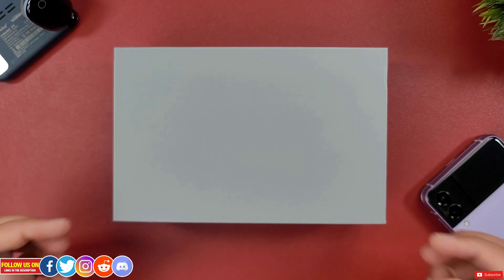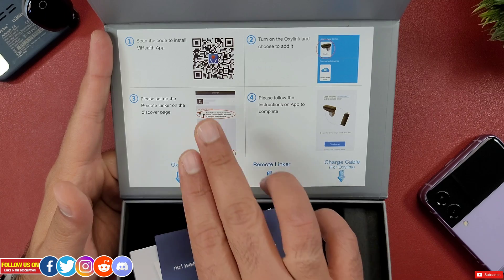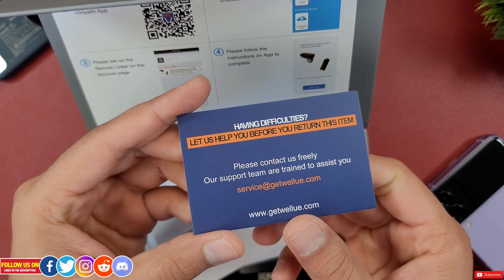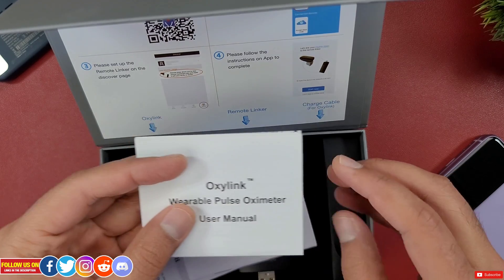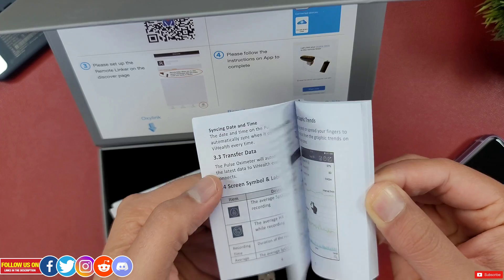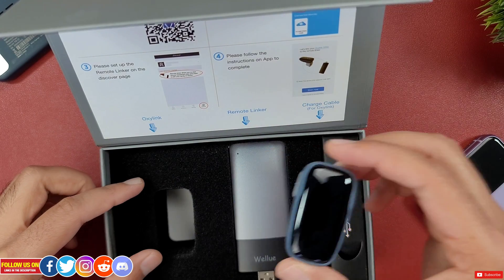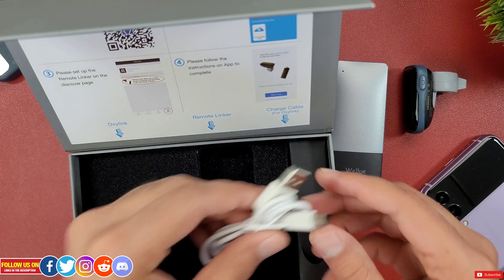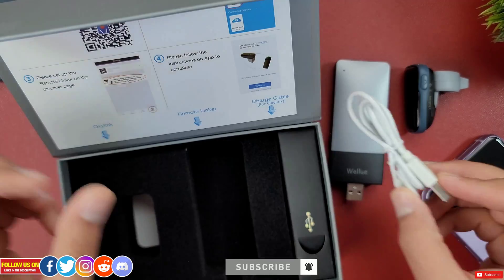In terms of unboxing, it came in a magnetic box that gives a premium feel. Under the lid are all the pairing instructions with the barcode for the ViHealth app. Inside the box there is a customer service card, the Oxylink wearable pulse oximeter user manual, a ViHealth app user guide, the remote linker user manual, the Oxylink oxygen monitor itself, a remote linker, and a USB Type-A to micro USB charging and data transfer cable.